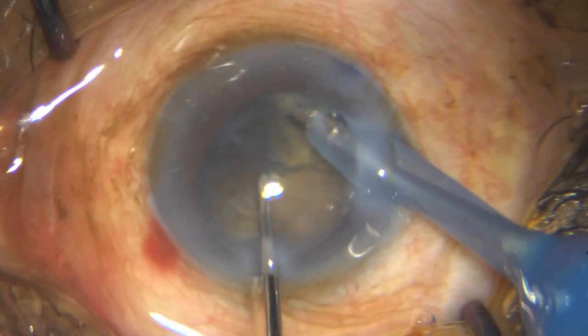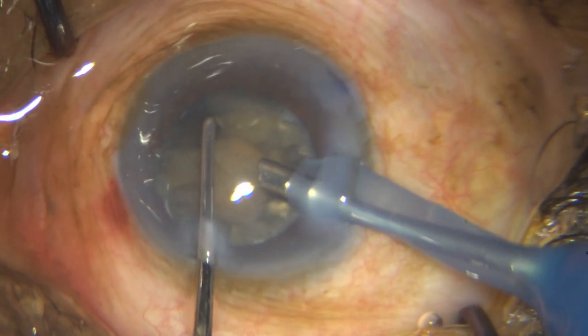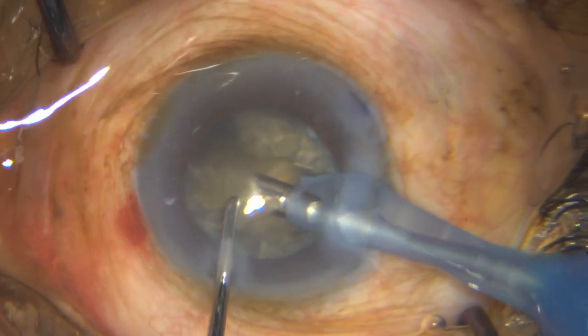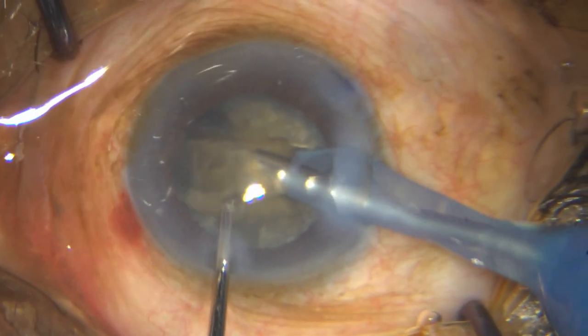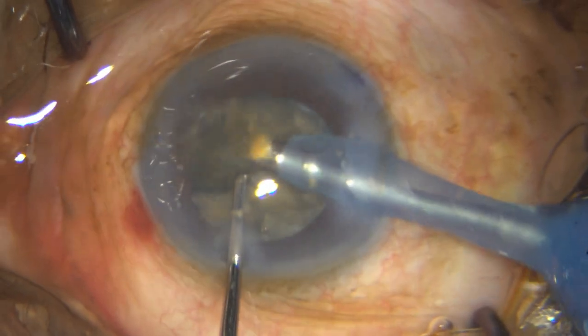That is the disc I am talking about. Once that is separated, I remove that disc. Then you can observe — luckily, these segments seem to be separated as well. So I have got one out, now I have got more space.